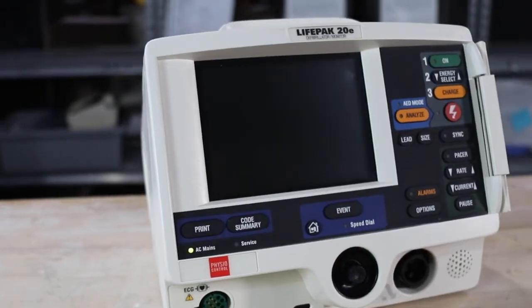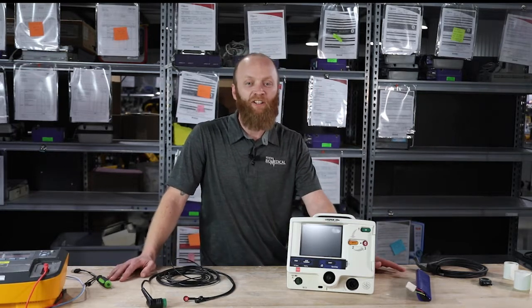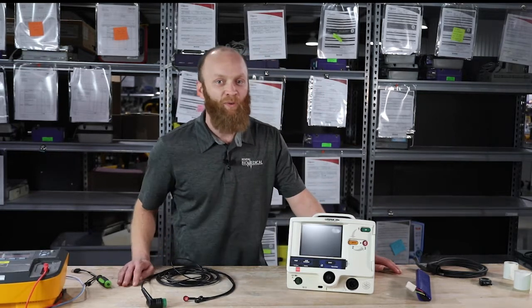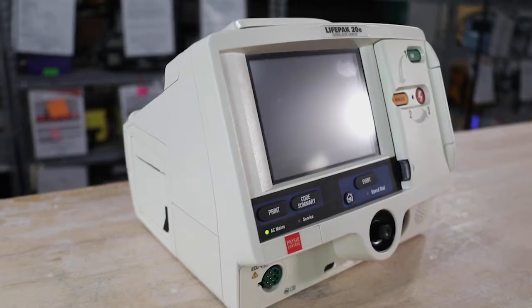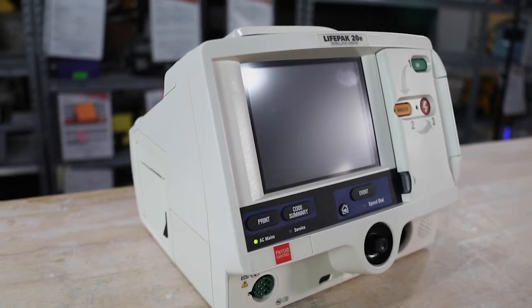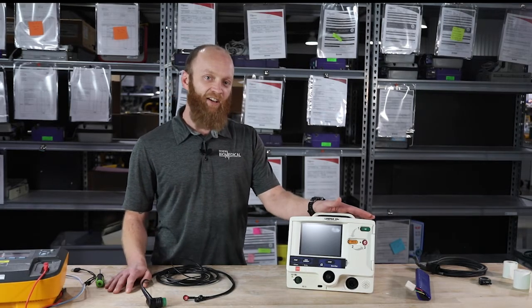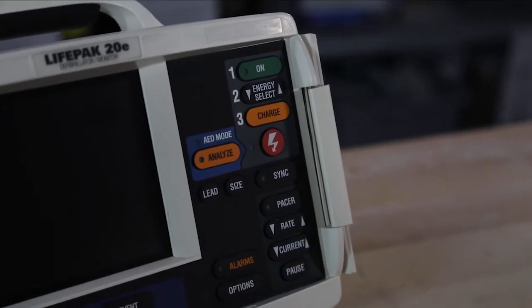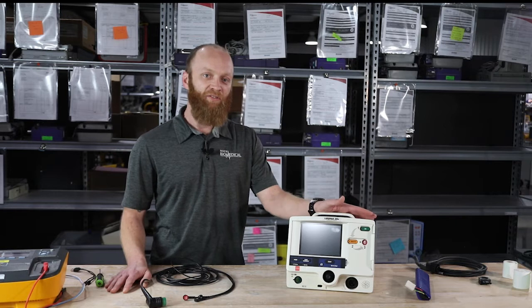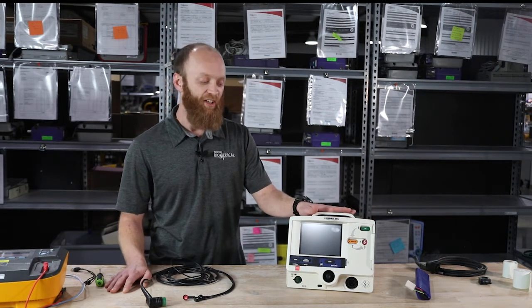Today we'll be going over the LifePak 20E. The difference between the LifePak 20E and earlier models such as the LifePak 12, or even the newer model, the LifePak 15: the 20E is more hospital use — it's smaller and compact, and it does 3-lead and 5-lead only. Your LifePak 12 was more EMS-based, it had a 12-lead option and Bluetooth transmission, which the LifePak 20E does not.